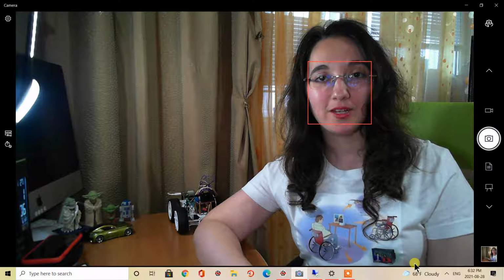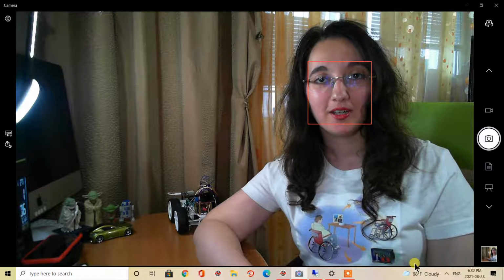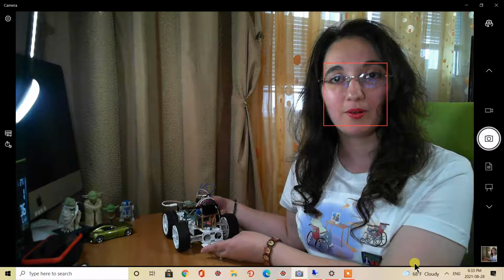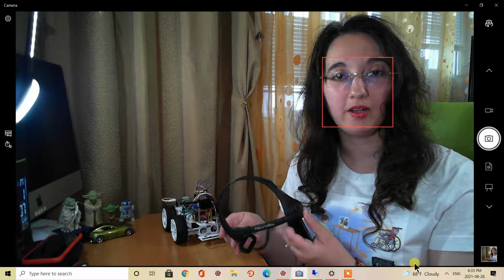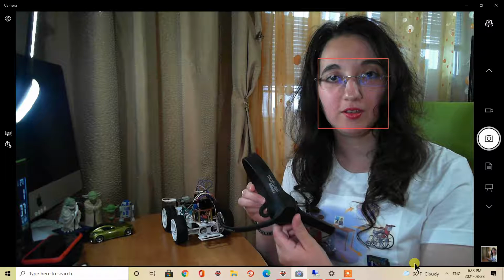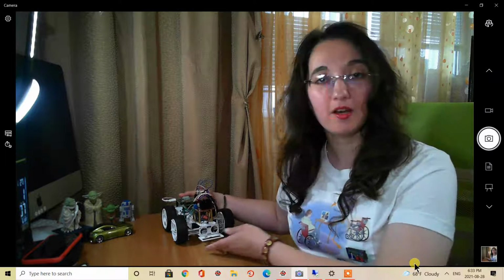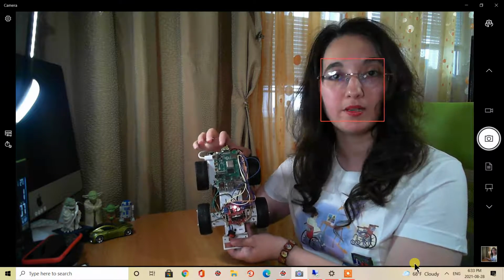In the next minutes, I will show you a live demonstration of my application, a simple brain-computer interface experimental prototype. It is based on the integration between the NeuroSky MindWave Mobile headset, the second edition that was released in 2018, and a mobile robot that is based on the Raspberry Pi development board.